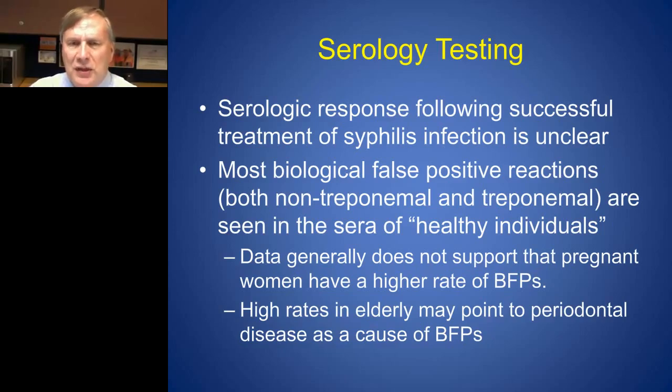And the higher rates in elderly may point to periodontal disease as a cause of biological false positives. And we talked about that earlier, about the spirochetes in the mouth. That's one of the reasons when we do a dark field, we don't do a dark field from any oral lesions, because there are other spirochetes. So spirochetes from an oral lesion is not necessarily diagnostic for syphilis, versus on the penis it certainly is. So one thing to remember from our dark field days.